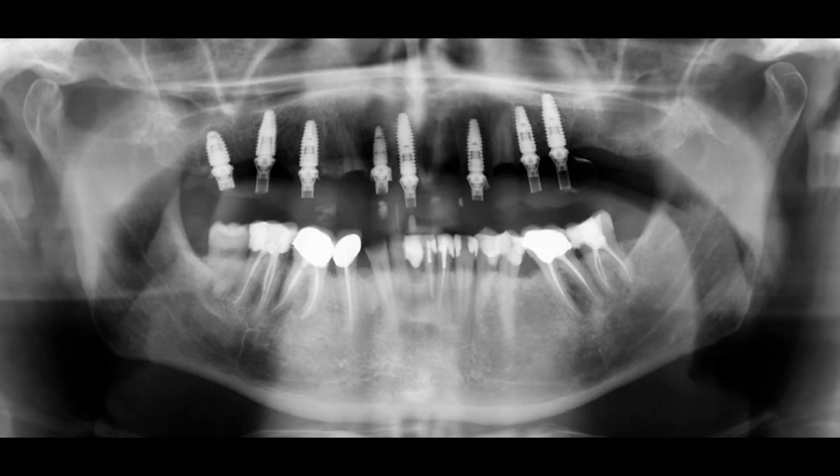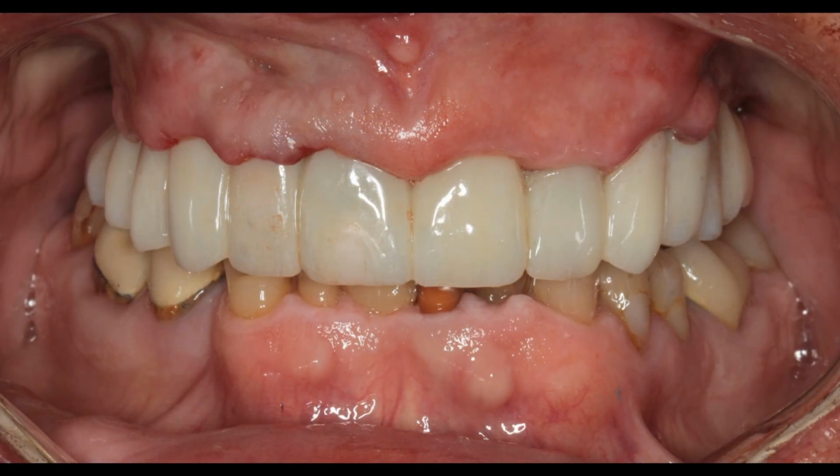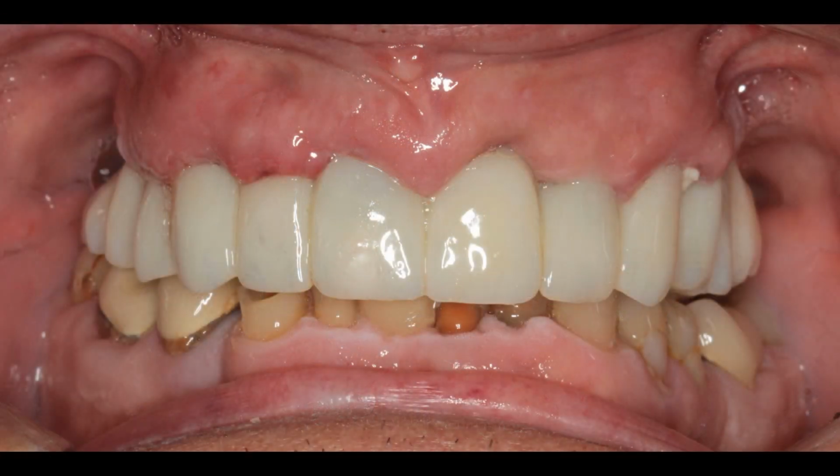So that first surgery, you can see I've left some roots behind, but I placed 8 implants, and he leaves here with this fixed temporary on those 8 implants. This is the day of surgery. And here he is 24 hours later.